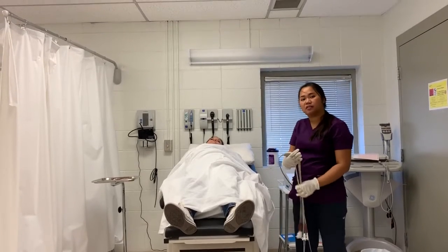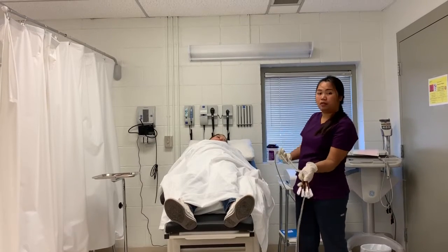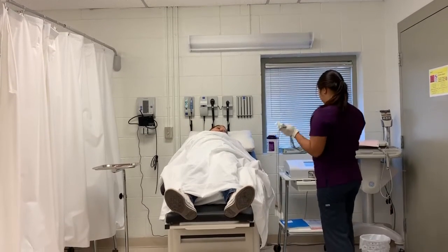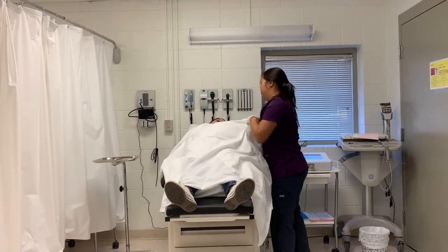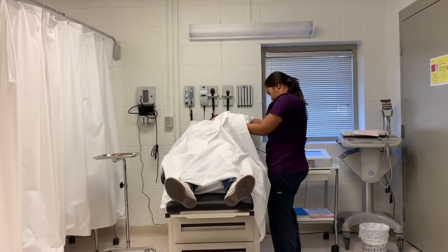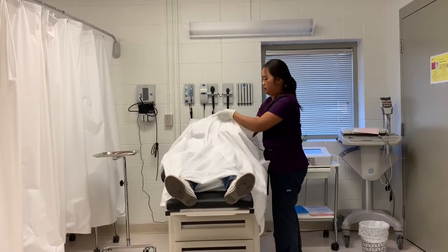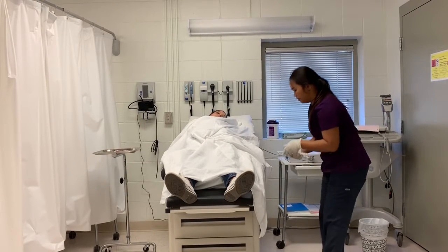So now that I've placed the electrodes on my patient, I'm going to go ahead and proceed in putting the lead wires on her. So I'm going to place this under her belly and work under the sheets. I'm going to go ahead and start with the limbs.